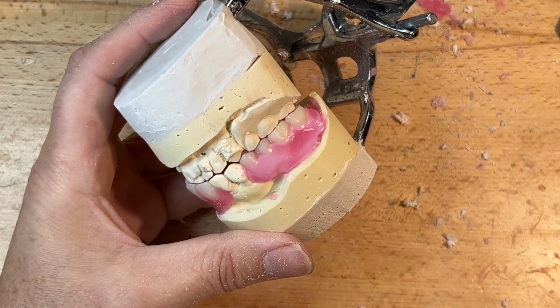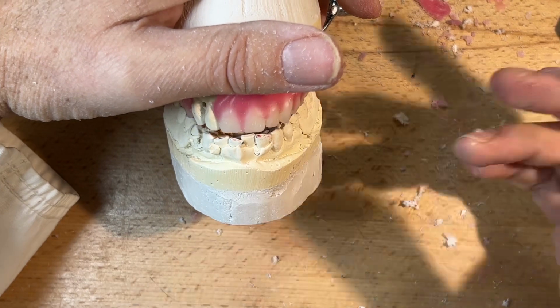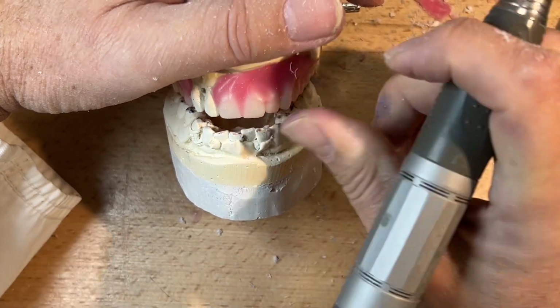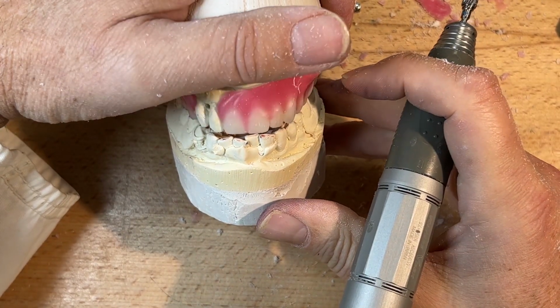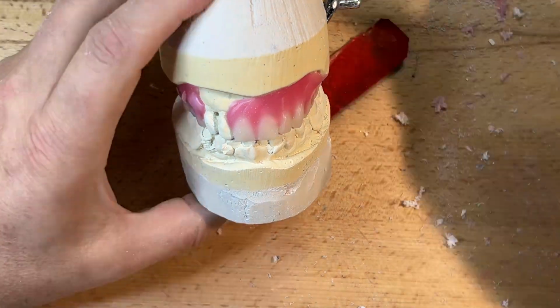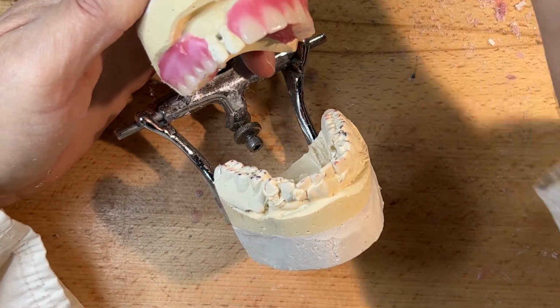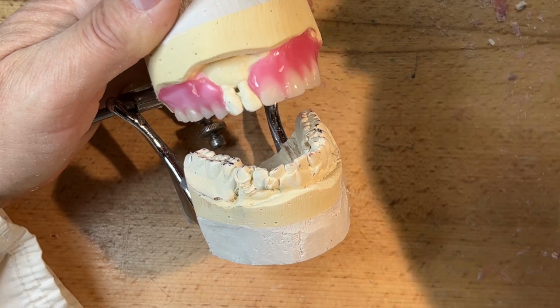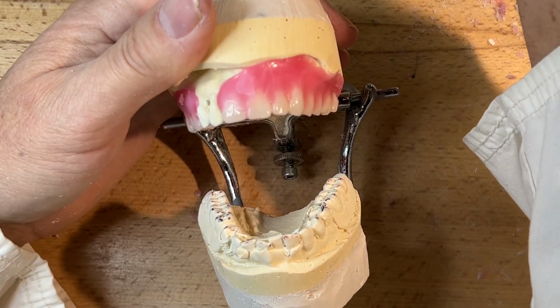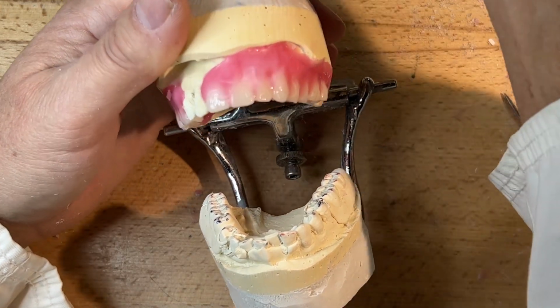I may leave some customized occlusal excursive movement grinding and maybe some incisal ledge grinding with the client at hand, so they feel that they have some participation. If they choose not to, and they say, oh, whatever you think's best, then I'll take that license in my own hand, so to speak, that creative license. I've already taken a lot of liberties today, but most of the liberties I've taken today are for functional improvements and necessary function excursive adjustments on the denture teeth.